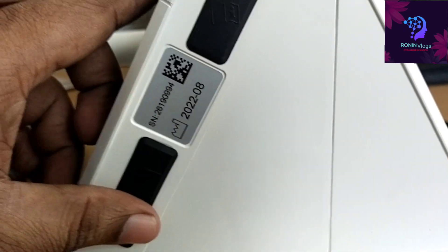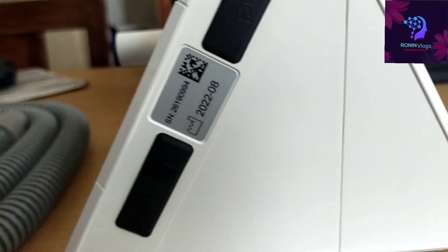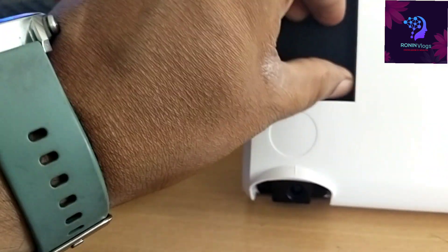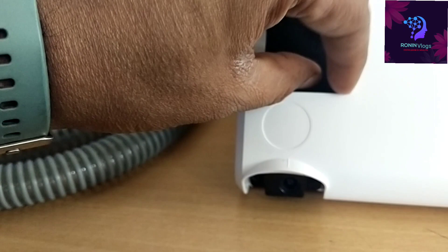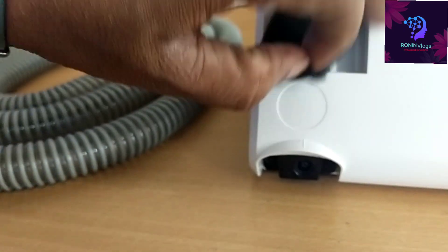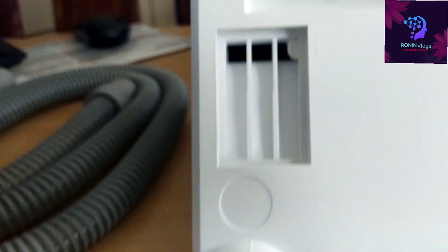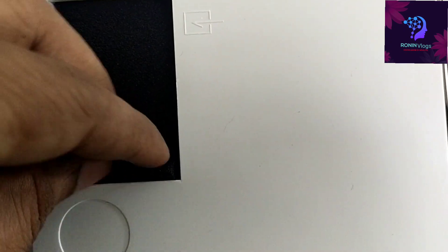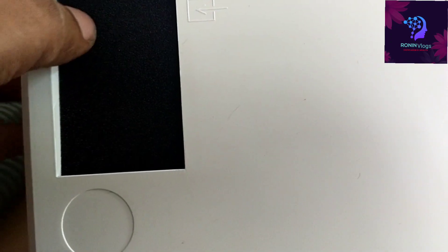This machine does not have battery backup — it only works through the power supply. This is the black color filter. After two weeks of continuous usage, we need to remove it, clean it under water, and after drying, put it back. Every six months we need to replace this filter.